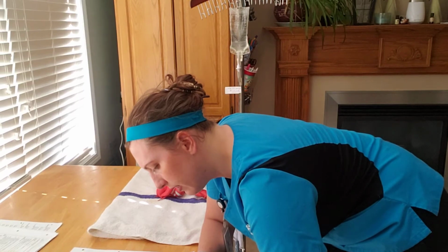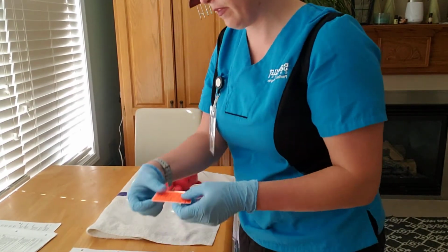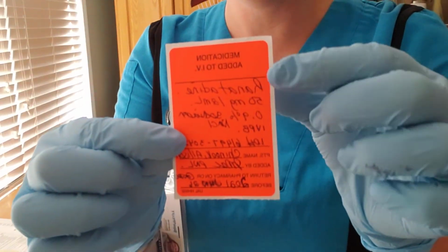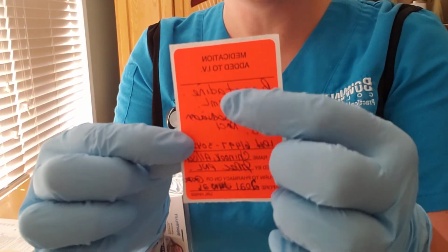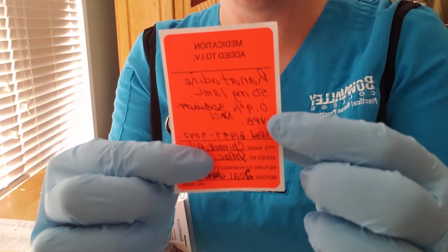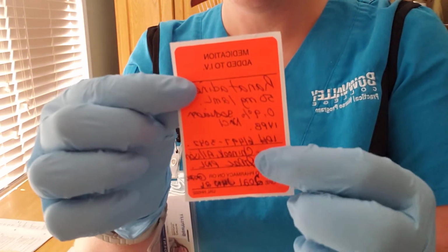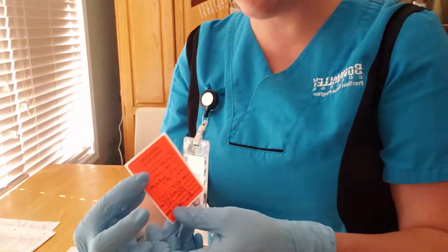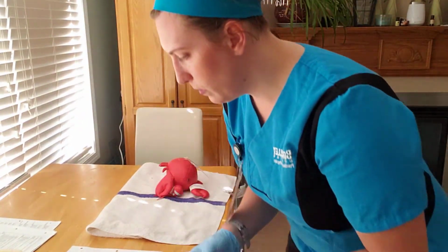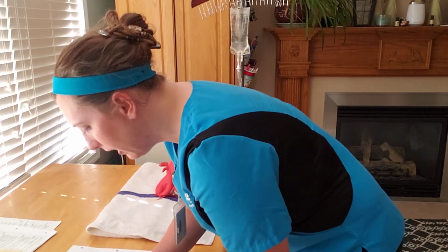And I forgot to indicate the route on here, so let's do that now. Okay. So my medication label states ranitidine 50 milligrams for 2 mils of medication, infused in sodium chloride for IV push piggyback for Allison Chinook, prepared by myself, and the date. So I'm placing this on the back of our mini bag.